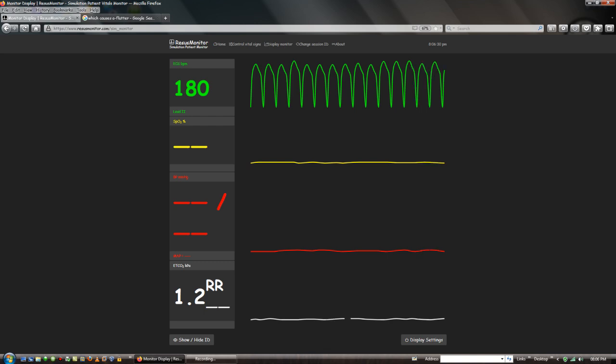You can see the SpO2 is very low with few waves, EtCO2, ABP, SpO2. These are showing few wave graphs, few ups and downs of waves, but in a very flat mode. But the EKG is the only one available to show the wide complexes and everything else.